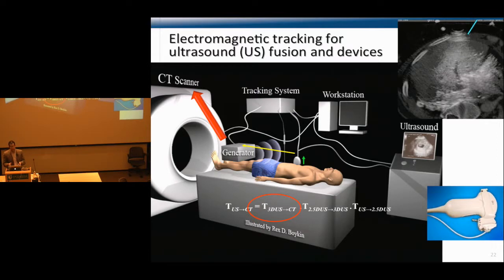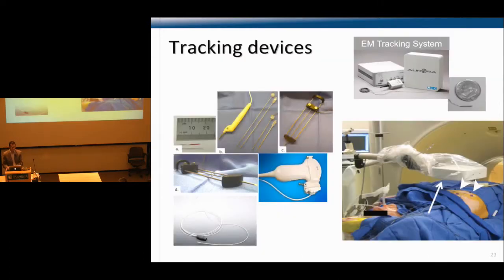A lot of the techniques in commercial systems right now use a point-based manual registration approach. What we're developing is a way to automate that framework to streamline the first phase, which in practice could take maybe 10, 15 minutes if it's point-based. If it's really manual, it could take a lot longer than that. So we're trying to really automate that framework.